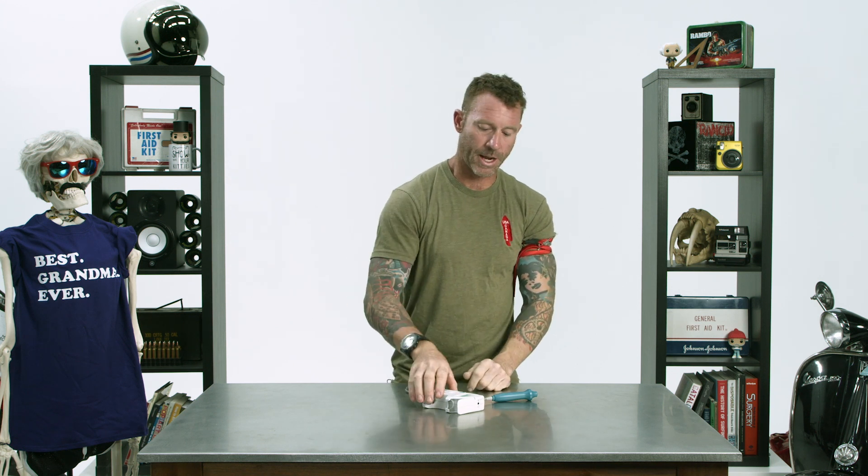This tourniquet gets a go. That's it for the rapid tourniquet, checking it out via Doppler — good to go with this tourniquet. Thanks for showing up and stepping up your first aid game. I'm Billy Haley, helping you stay alive.